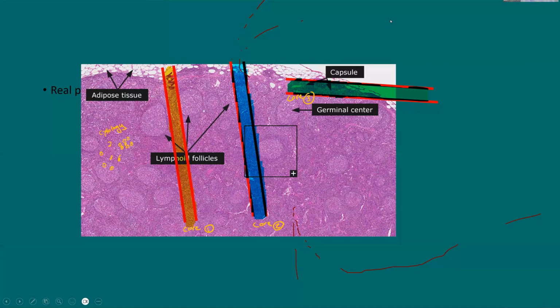When we talk about lymph node core biopsies, it's important to assess the adequacy of the cores, and you can imagine this is just a theoretical core biopsy through the lymph node that I showed you earlier. If we take cytology, we are sampling multiple tissues from multiple areas of the lymph node. But if we take a core 1 biopsy, for example, we will be sampling the interfollicular areas only, without much architecture of the follicles to see.